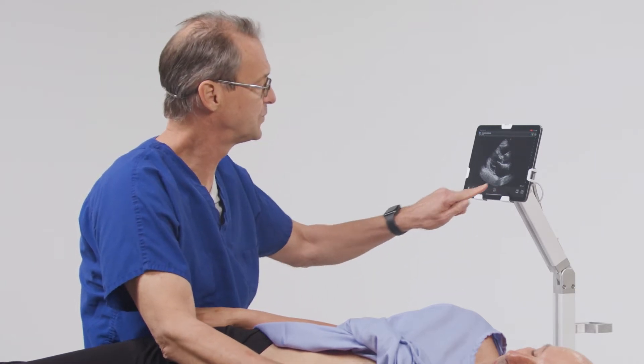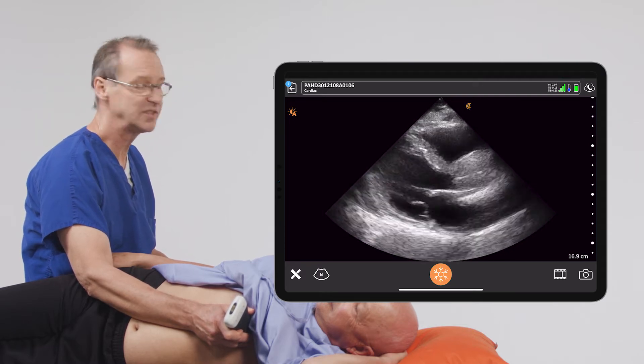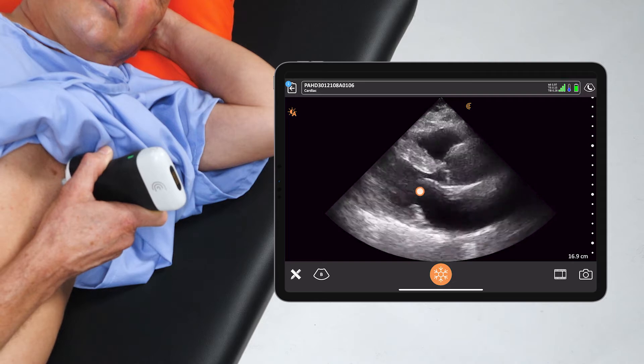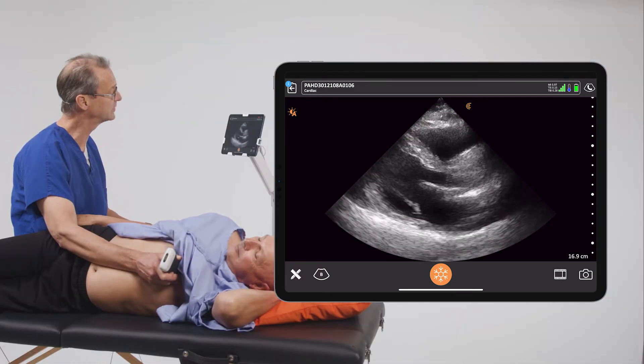We'll get a parasternal long axis view of our patient today. And as you can see right away, the anterior leaflet of the mitral valve moves and makes contact with the interventricular septum in diastole. We can see that is one indication that he has great left ventricular function.